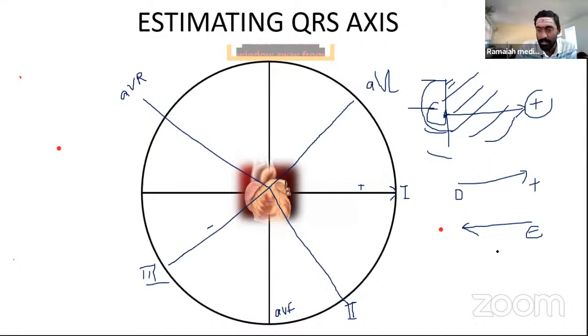This was the resolution of vectors that we had. So can someone tell me what would this lead be? So this point, what can we call this? If this was lead 1 in this direction, what would this be called, if it is in this direction, exact opposite? You call it correct, very good. So negative 1, very good. So it's called the negative of this wave because we add a negative charge to it.